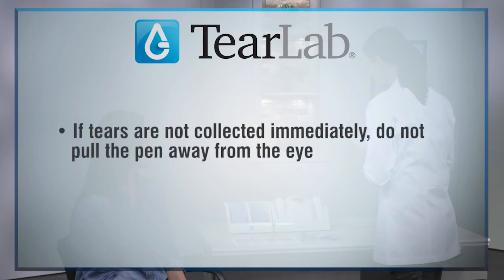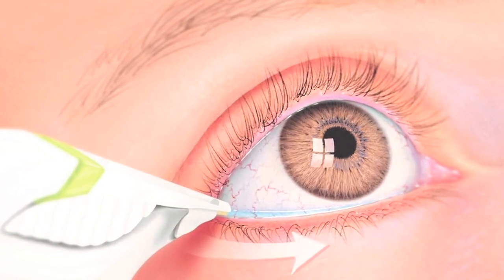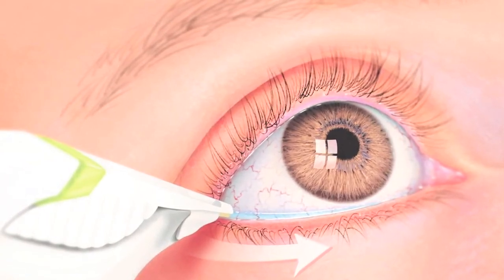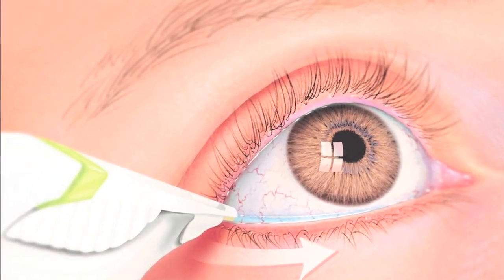If tears are not collected immediately, do not pull the pen away from the eye. Leaving the test card in contact with the eyelid, lightly brush the pen back and forth along the outer 1/3 of the lid, avoiding the cornea.